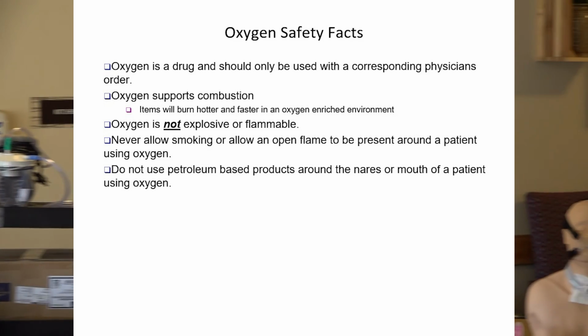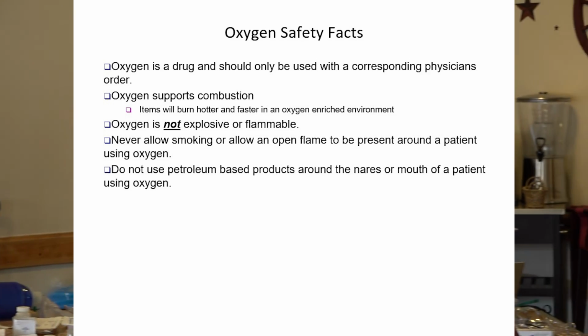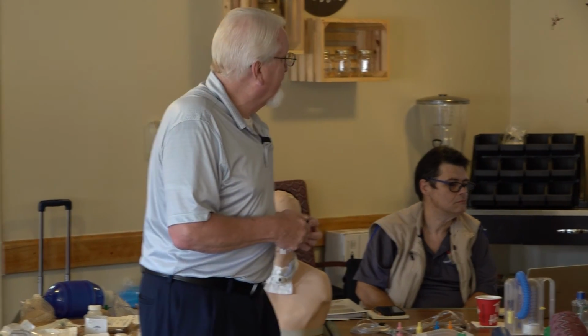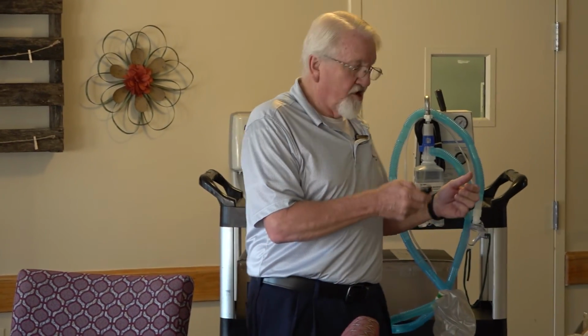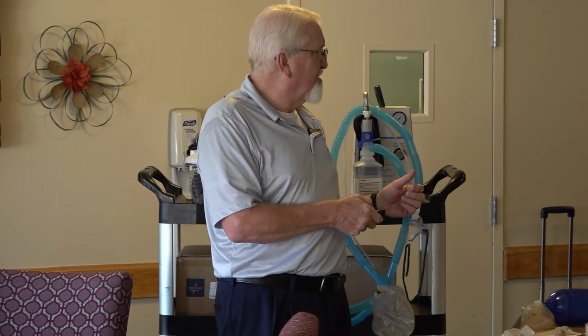Oxygen is not explosive. It just feeds fire by providing it with oxygen to burn. A fire has to have oxygen to burn.